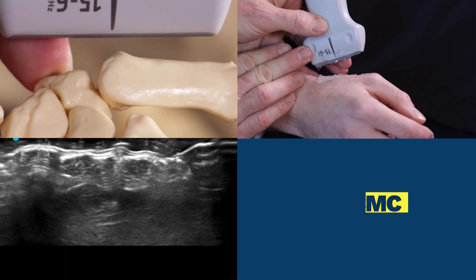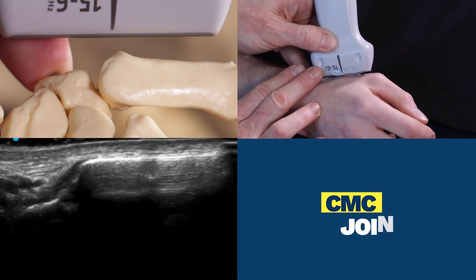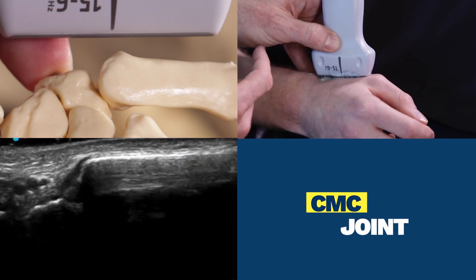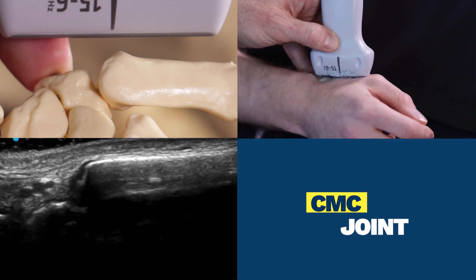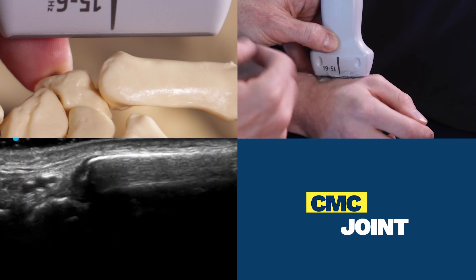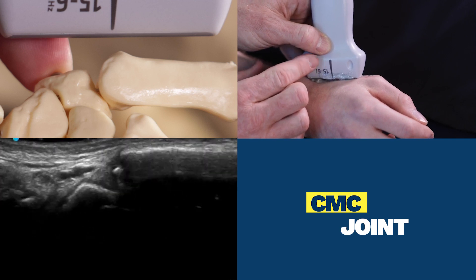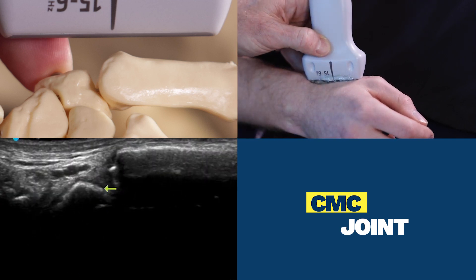Either way, your landmark is going to be the first metacarpal. We now have that in view. Your orientation is long on the metacarpal, and your movements are going to be proximal until the end of the metacarpal. We now see the area of interest highlighted with the yellow arrow.